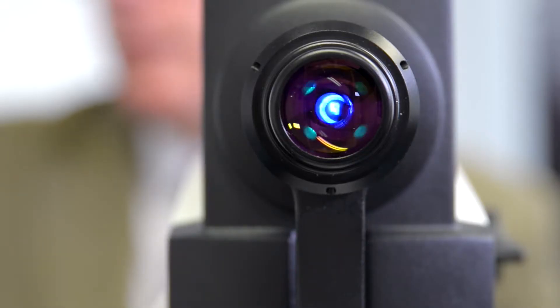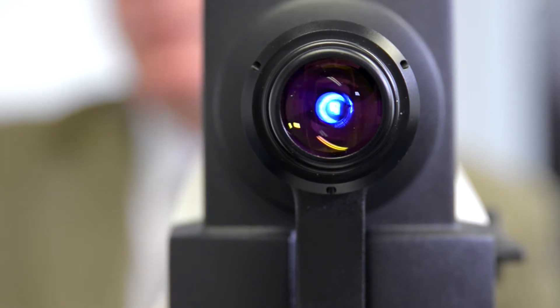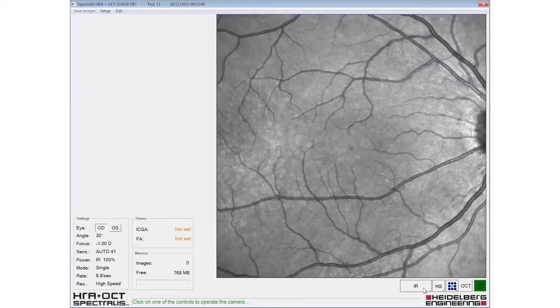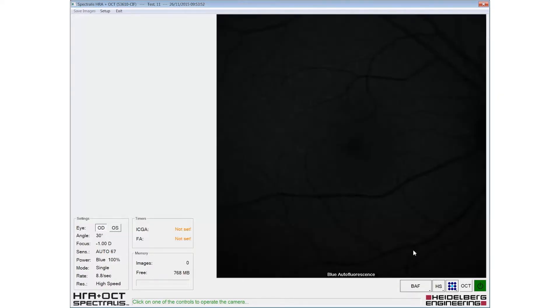The patient should be reminded that an intense blue light will be used during the examination. The blue autofluorescence modality should then be selected from the pop-up menu.